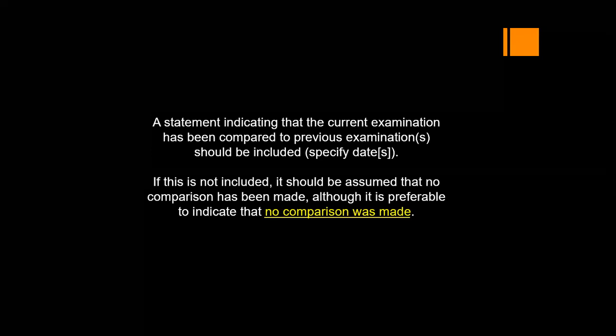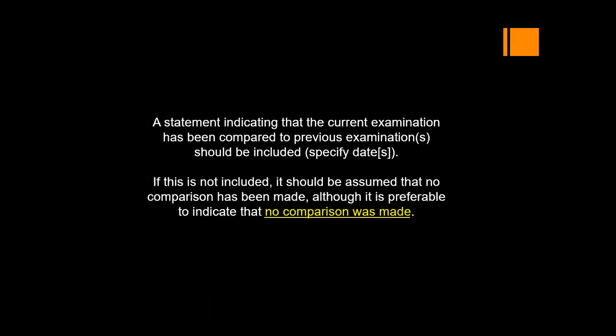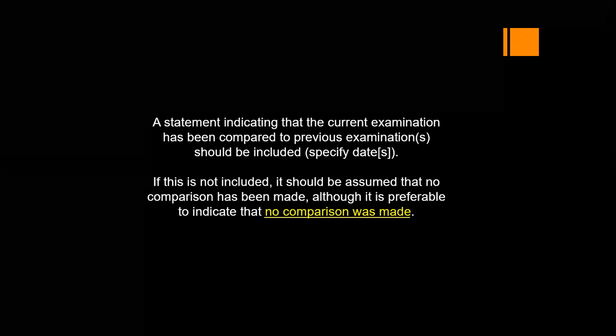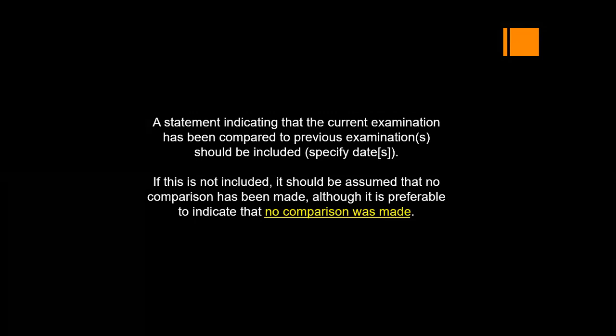A statement indicating the current examination has been compared to the previous examination should be included with the specific dates, okay? And if not included, it should be assumed that no comparison has been made. However, it is preferable that if no comparison has occurred, you mention that in the report.